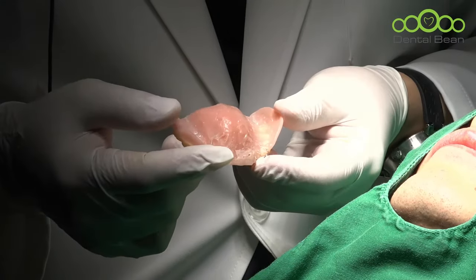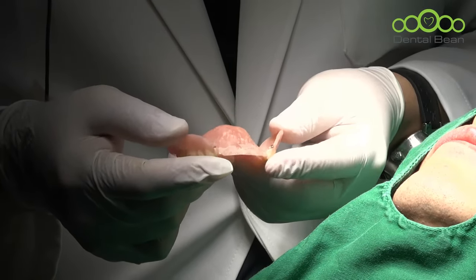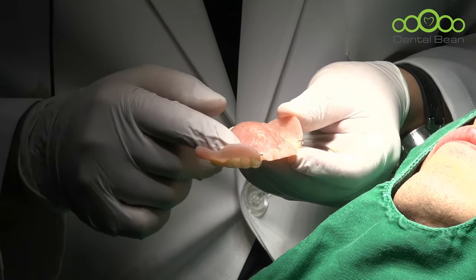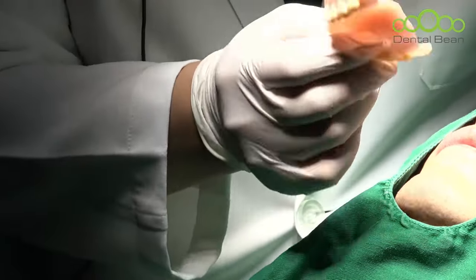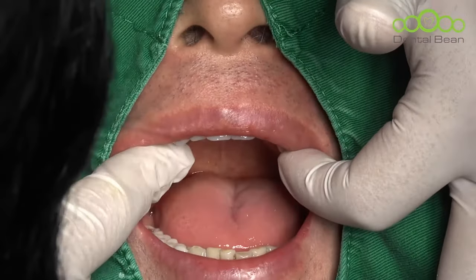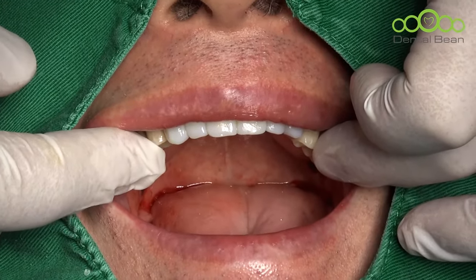This is a temporary RPD. This patient has been wearing this RPD for several months. And I already trimmed back inside the denture base. Then you make sure this denture doesn't contact the implant site and bone graft site. And occlusion. Please close your mouth.